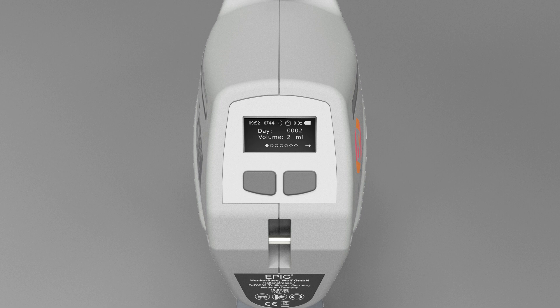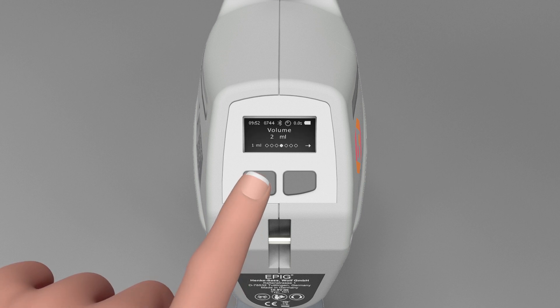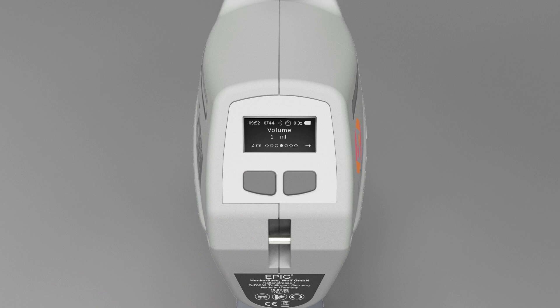The user menu is divided into two levels. The first level contains all settings that need to be changed or reset frequently, such as different counters and the injection volume.